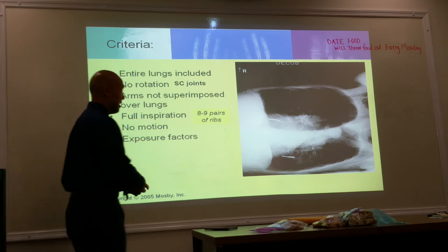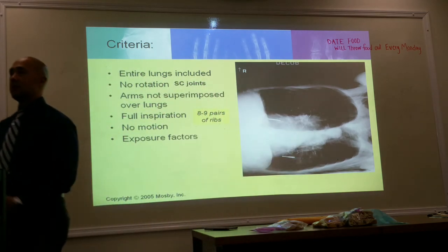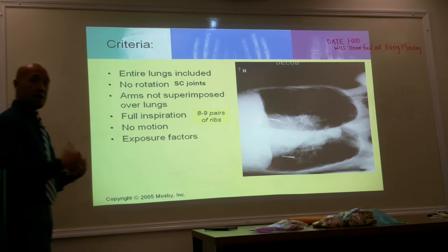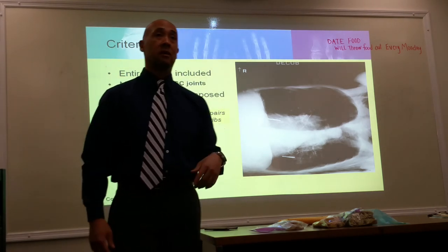We do have appropriate penetration because we can see behind the heart, but it's so dark I can't even see lungs and lung markings. For decubitus, you said we could also do it supine or prone, right? What would be the purpose of those ones? They're going like a lateral projection, if they're laying on their back? Yeah. This is to demonstrate an aortic aneurysm. Oh, that's right. We'll cover that later on.